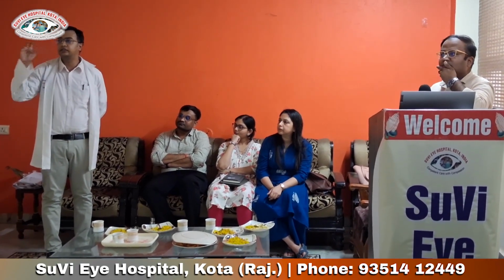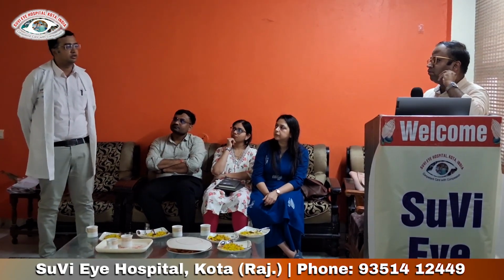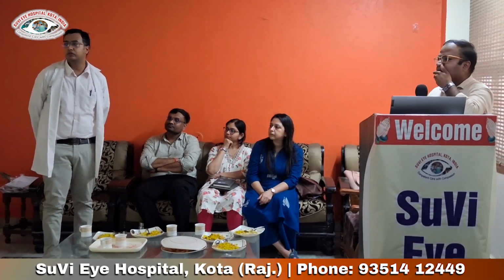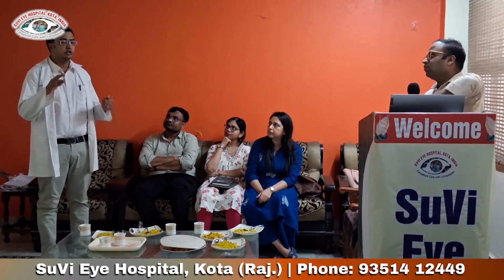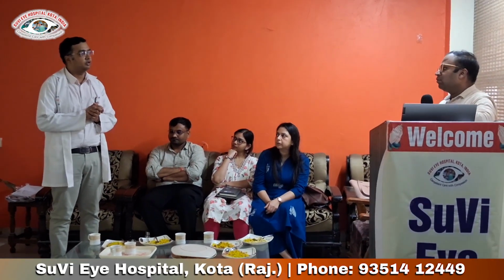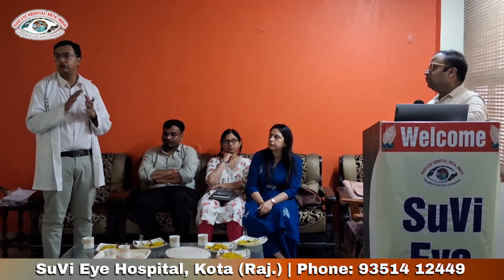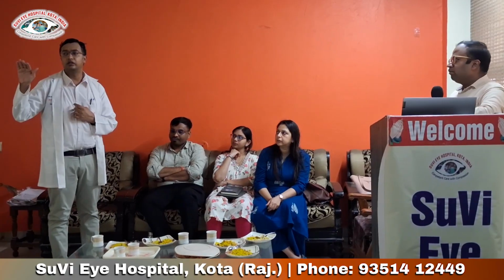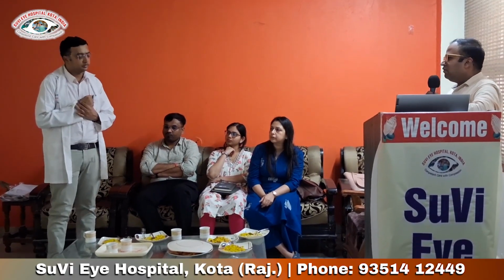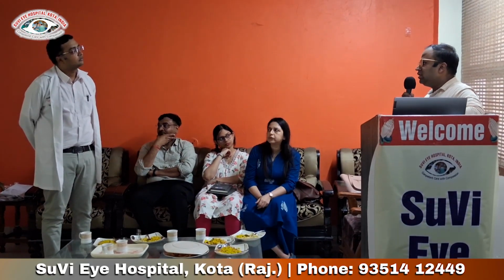Dr. Anuj, like any studies, when would you go for laser PRP, pan-retinal photocoagulation, or a sectoral PRP? It was a fresh supratemporal retinal vein occlusion with macular edema. So would you go for a PRP in that case, or when would you go for a PRP as per the BRVO, BVOS and CVOS studies? If there is absence of macular edema and only presence of neovascularization, then we would consider going for PRP therapy.